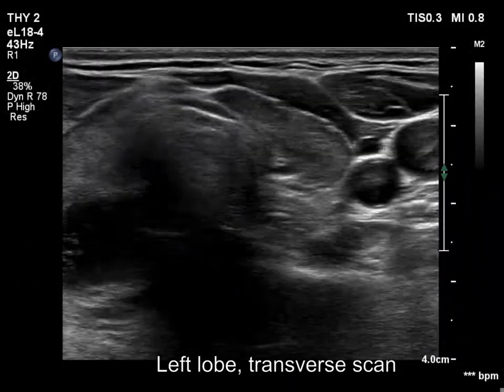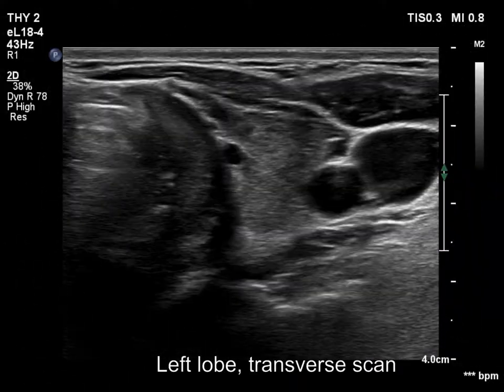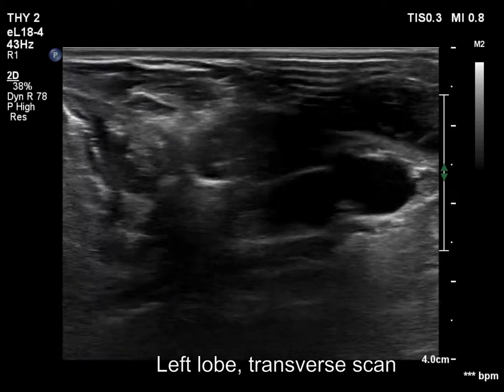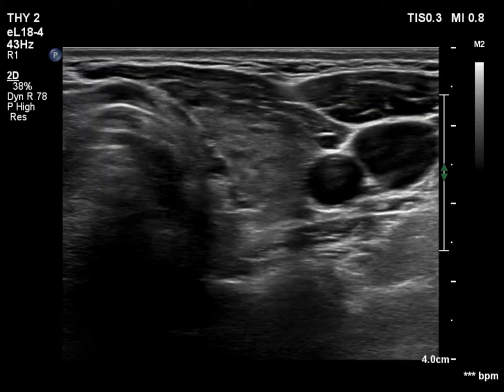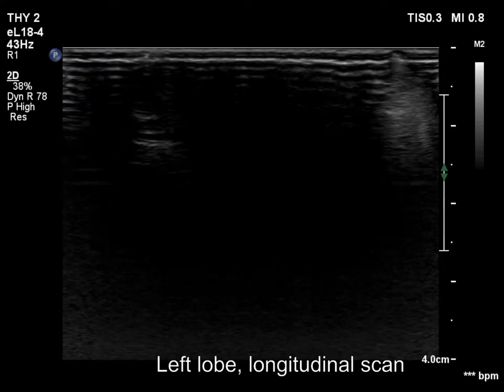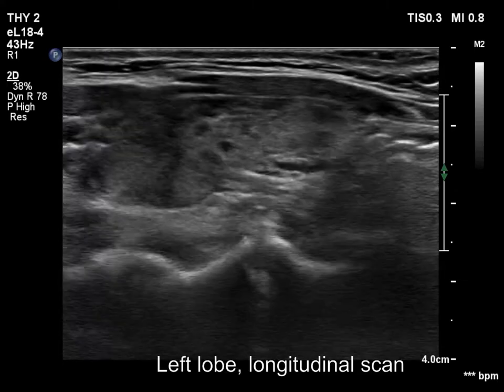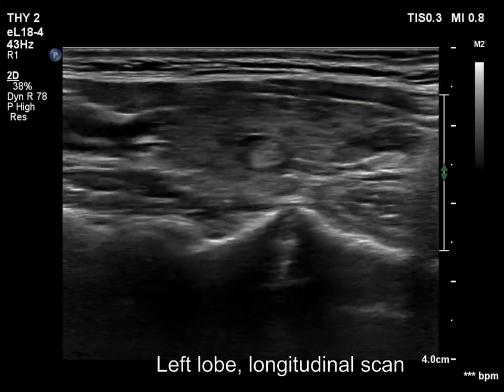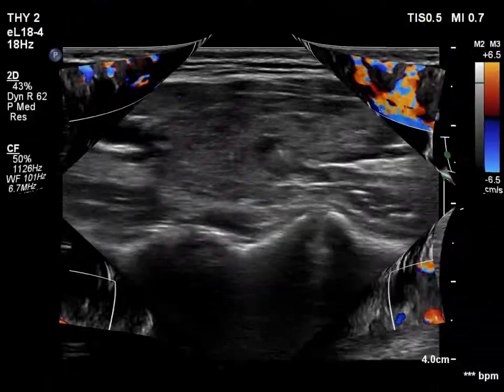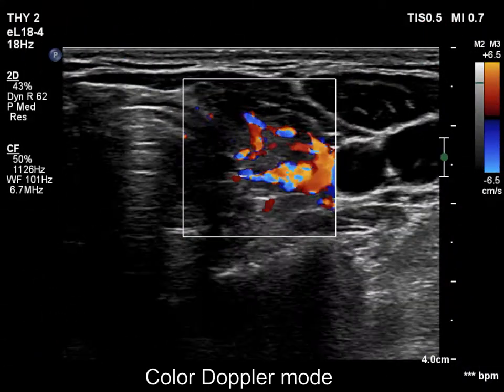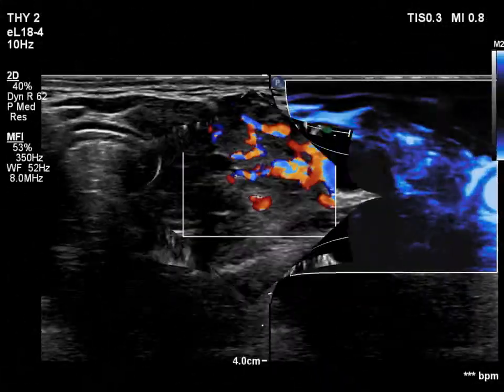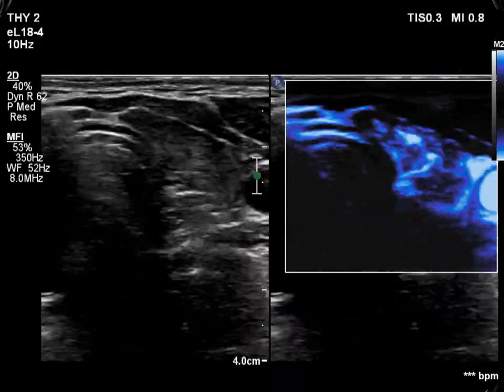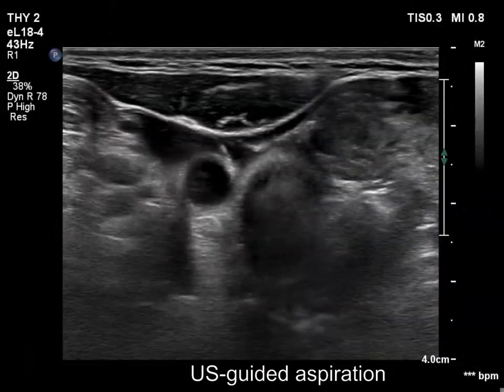The left lobe has a similar presentation. The pattern is consistent with autoimmune thyroiditis. The vascularization is increased.